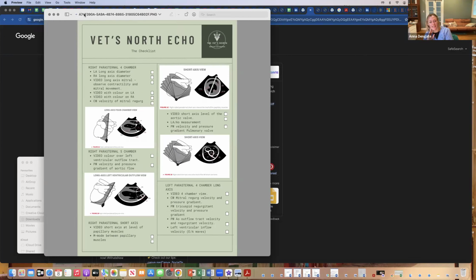Essentially, this is a summary of the list that we've got on our form that we do our echoes off. It's just got a checklist of the views that I want you to get. We're going to go through that in more detail in the document that Jane's put together. But this is just a bit of a summary document.